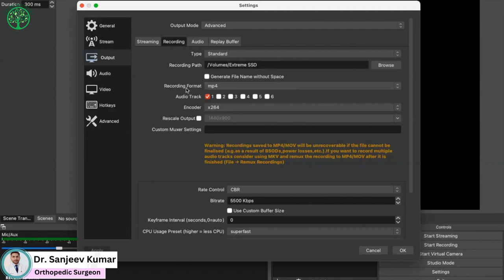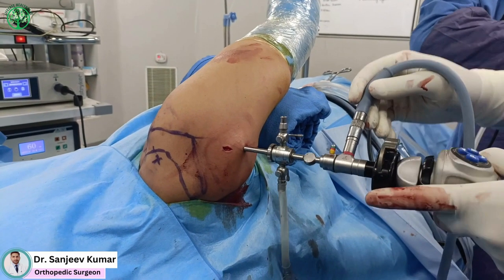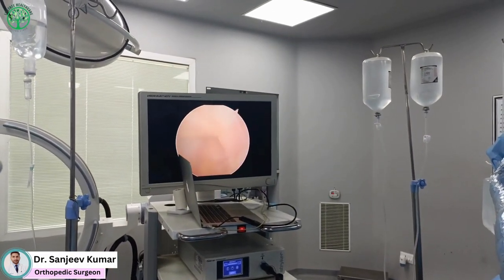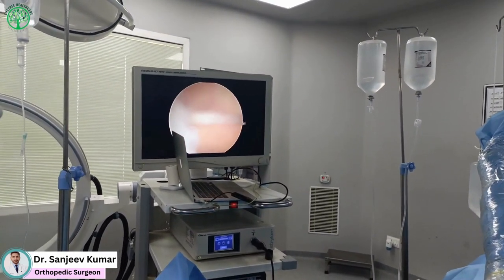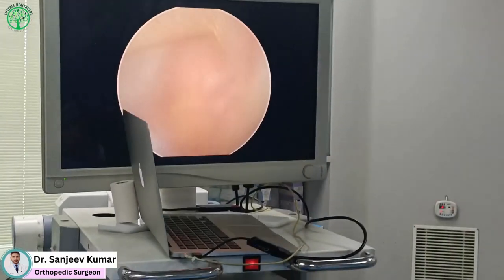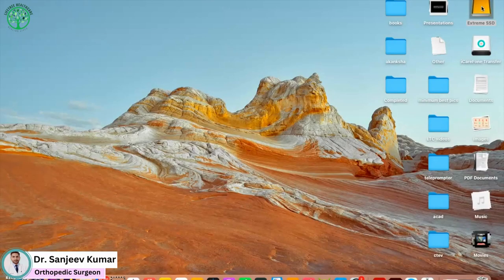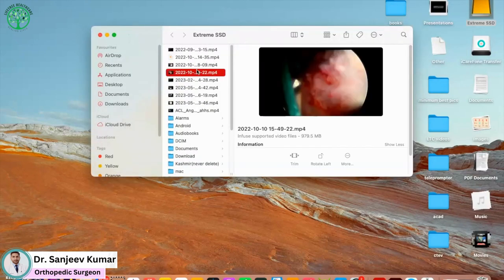In recording format, you can change the format according to your need, then you can start recording. Keep in mind that you need to stop the recording before removing the camera head from the camera or turning off the camera switch, otherwise the recording file gets damaged. Now you can open the recording file from the storage location and watch it.